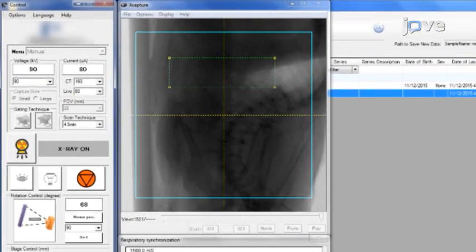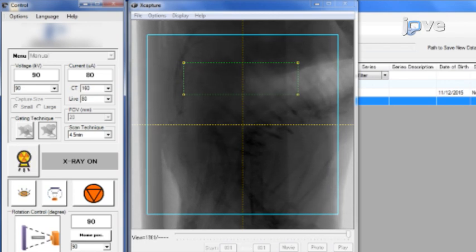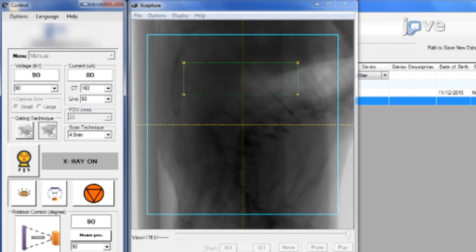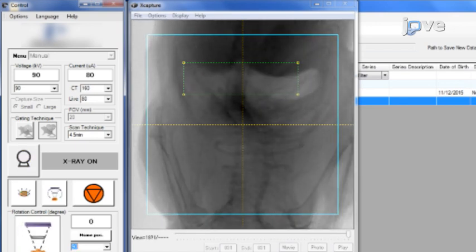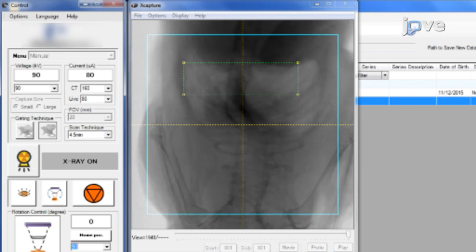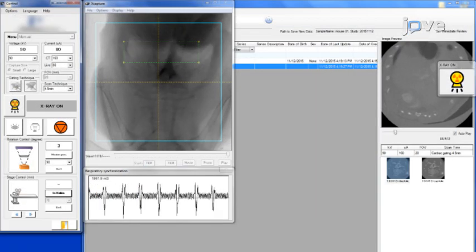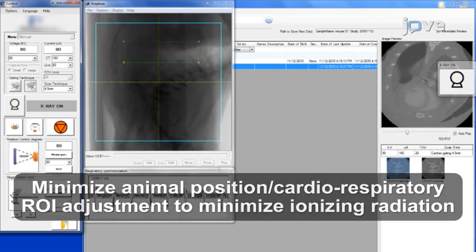In the x-capture window, left-click the mouse to resize the cardiorespiratory region of interest, dragging the edges so that the cardiorespiratory traces are clearly visible in the synchronization view. Press the Home position and resize the region of interest for cardiorespiratory gating. Make sure that the region of interest covers the diaphragm and the apical portion of the heart in all of the gantry positions. Then rotate the gantry 90 degrees to make sure that the cardiorespiratory traces are still clearly visible.